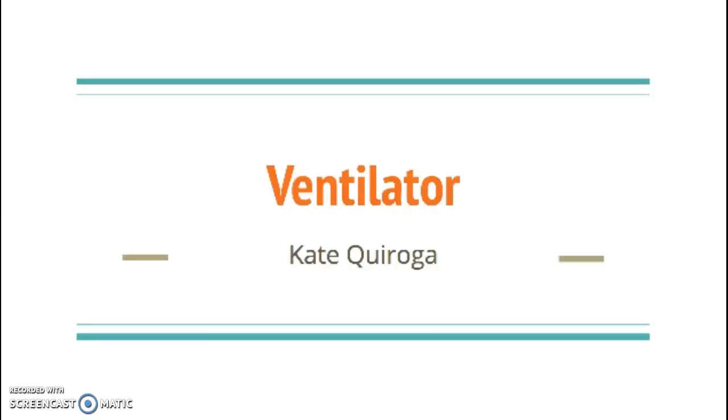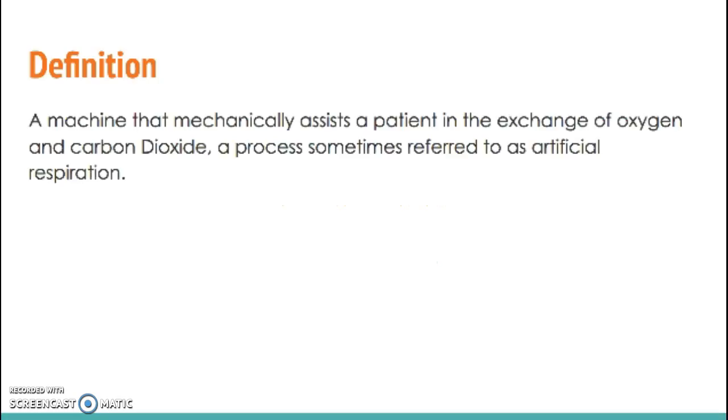My biomedical device is the ventilator and the endotracheal tube. To define a ventilator, it's basically a machine that mechanically assists a patient in the exchange of oxygen and carbon dioxide. So it's like artificial respiration.